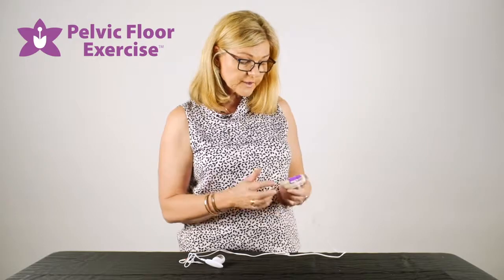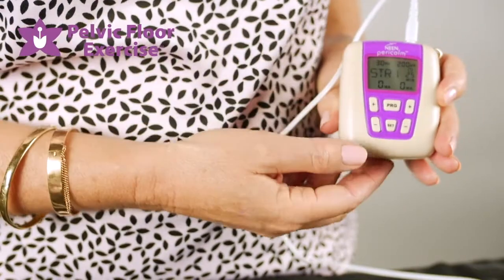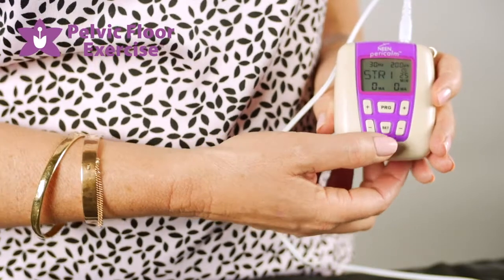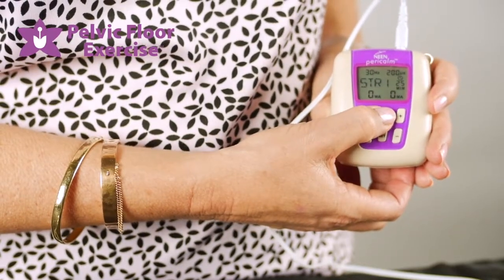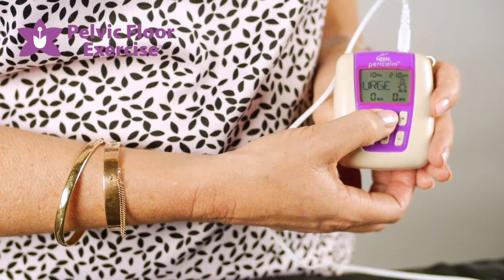We're then going to turn the machine on. The on/off button is on the top of the Pericarm, so we press that and you'll see on the screen there'll be some numbers which relate to the parameters of the program that's on the screen.